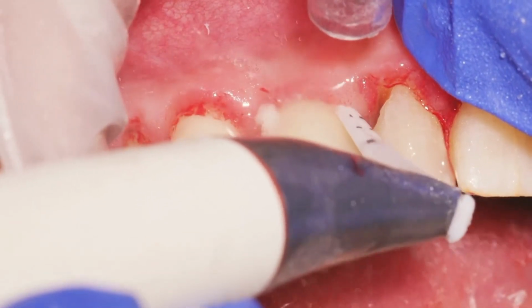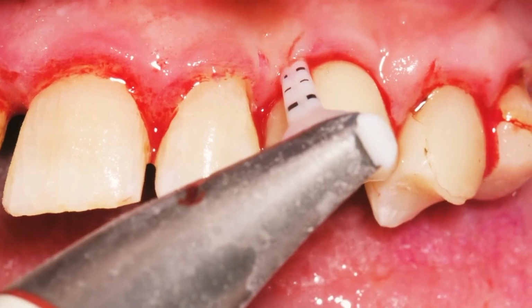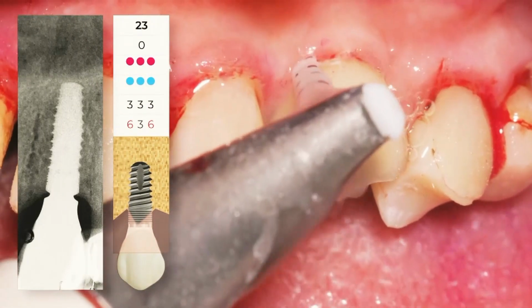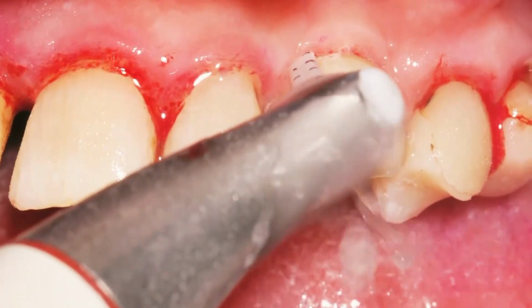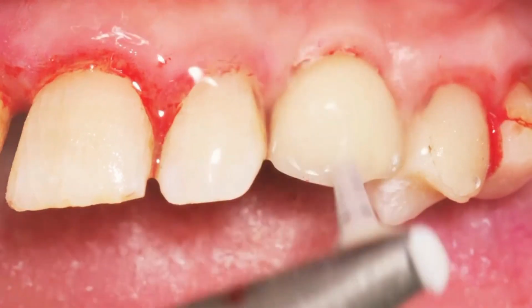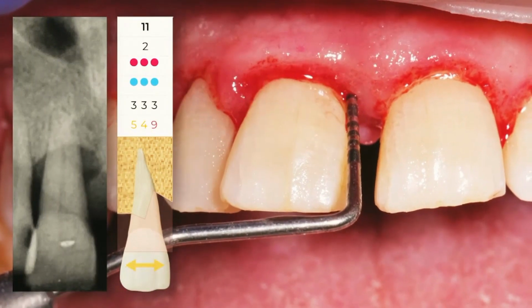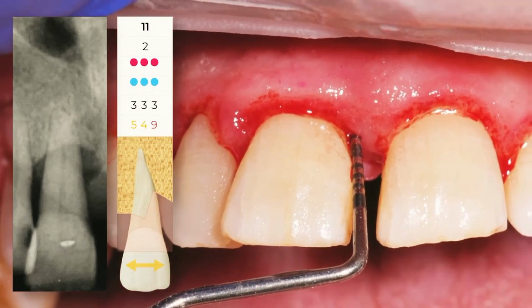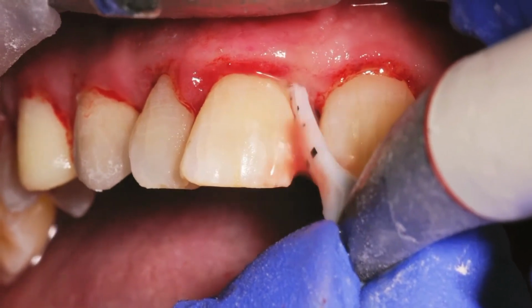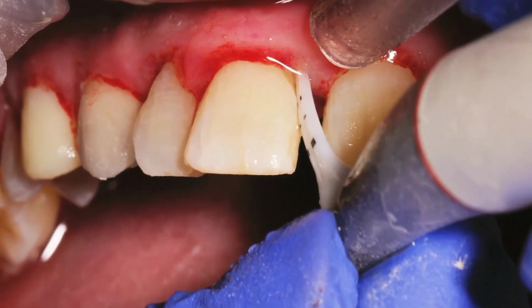And you can see here in this implant, in those mucositis implants, how the nozzle is comfortable and is useful to clean the crown, to clean the transmucosal tunnel, to clean the abutment area. And also in these severe and deep pockets in this 1.1 incisor.